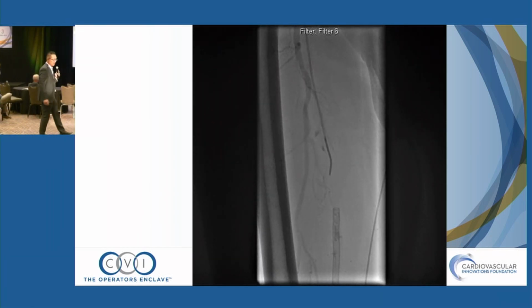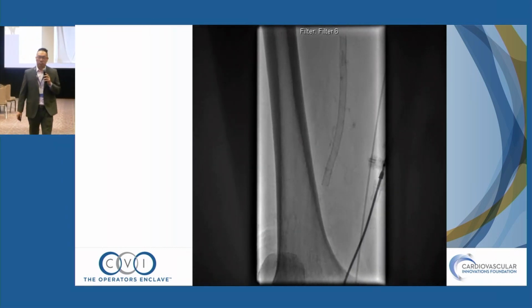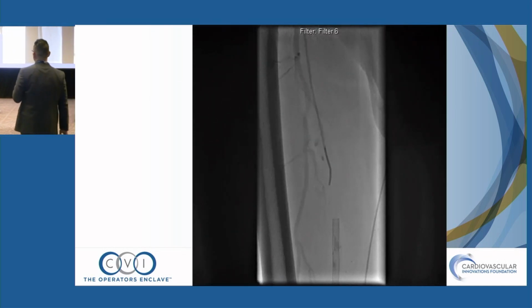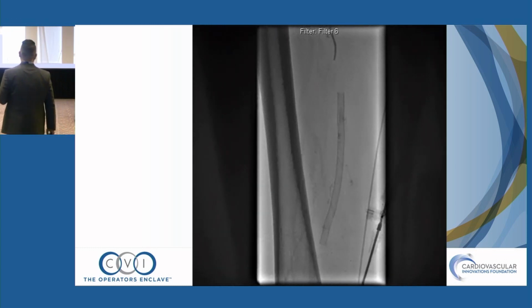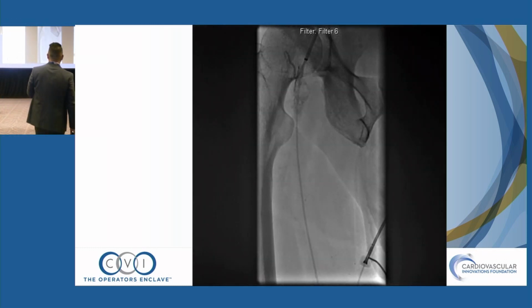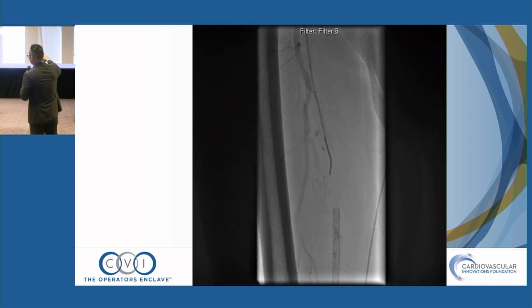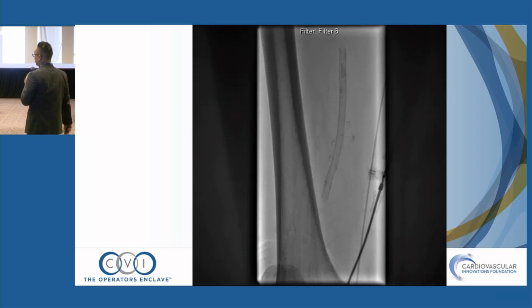Any tips? Well, you're already close to a place where you can get your wire in with a little loop, and you can see if you can go all the way into that stent. Hopefully it won't go behind the stent, but at least it's worth a try via the antegrade approach, if you can. What about at the very top, before I crossed here? If it's a flush occlusion SFA, what are you doing? What are the couple of steps to make sure it's flush for new guys?